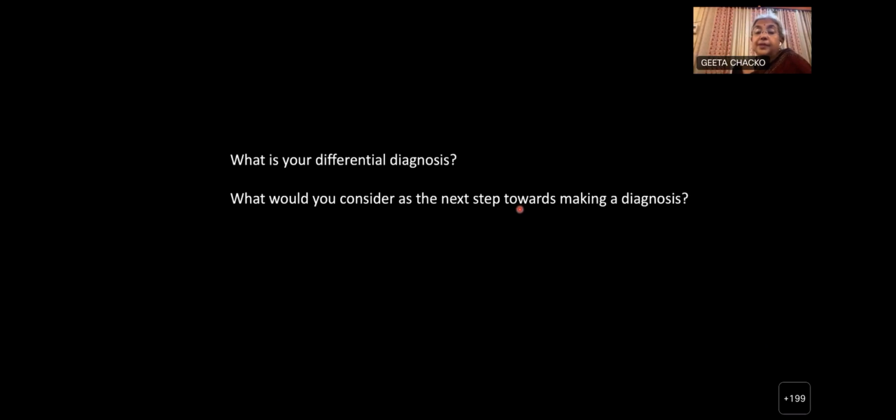So now, how is your mind working on this case? What would you like to do next? I'd say IDH. You want to do IDH. Okay. At this point, we have a 15-year-old with a how many year history of seizures? 9-year history. So that means from the age of 6, this child has had seizures, right? So it's fairly long standing. And you said you saw an oligo-like morphology, and you want to do an IDH because you're thinking of an oligodendroglioma. But an oligodendroglioma generally would not have such a long standing history. It would be a shorter duration of symptoms.